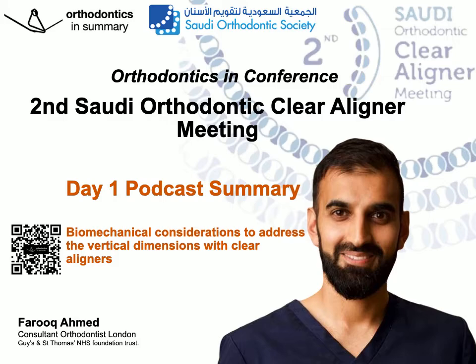So starting off looking at the concepts he described. The first was that of intrusion. He described how there's no attachment for intrusion. And actually what we require are attachments on the adjacent teeth. He drew a really neat analogy looking at fixed appliances. If we put an intrusion bend in, the only way it works is because we've got two brackets adjacent to that tooth to provide anchorage. And it's the same thing with aligners.